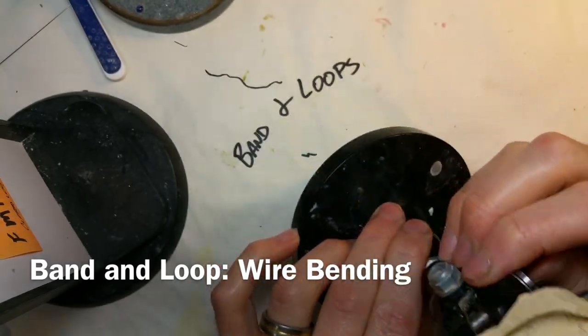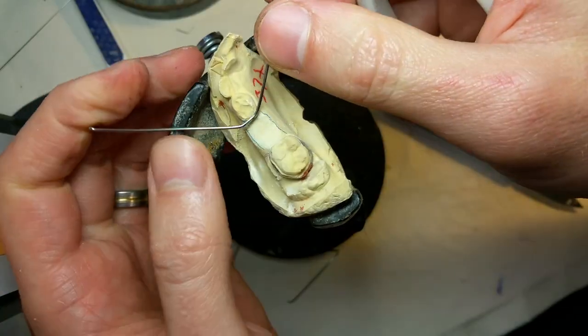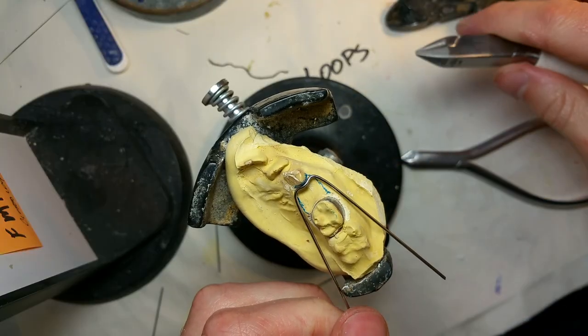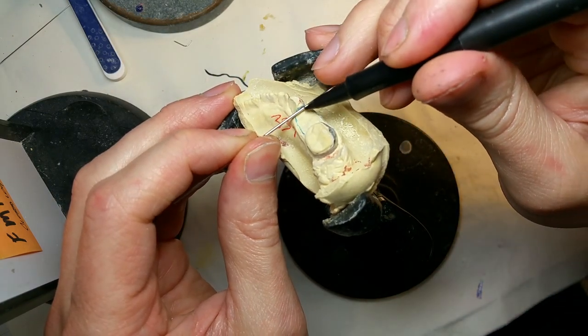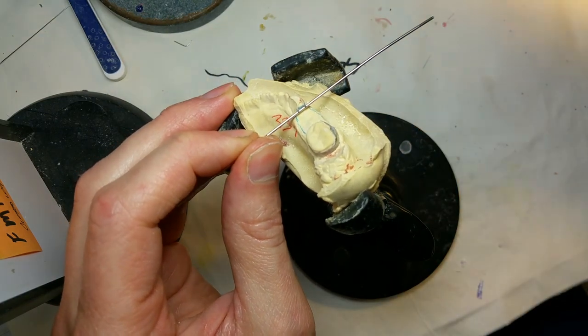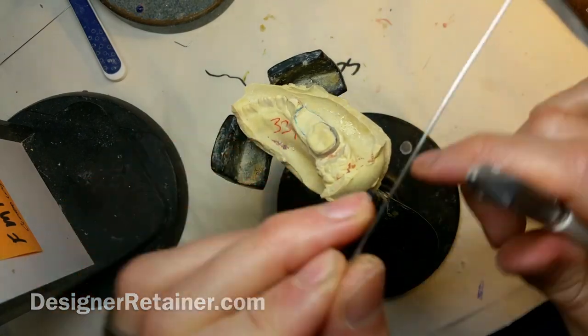Band and loops — one of the staples of the orthodontic laboratory. I had five of them, so I decided to put my camera up and record myself bending these. This is the shortened version of the whole boring video, but if you'd like to see the full version, it's over at designerretainer.com.